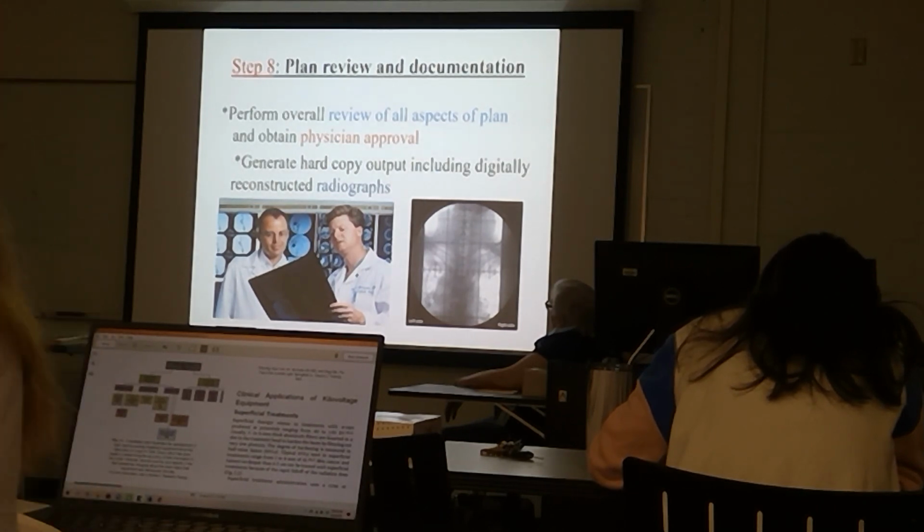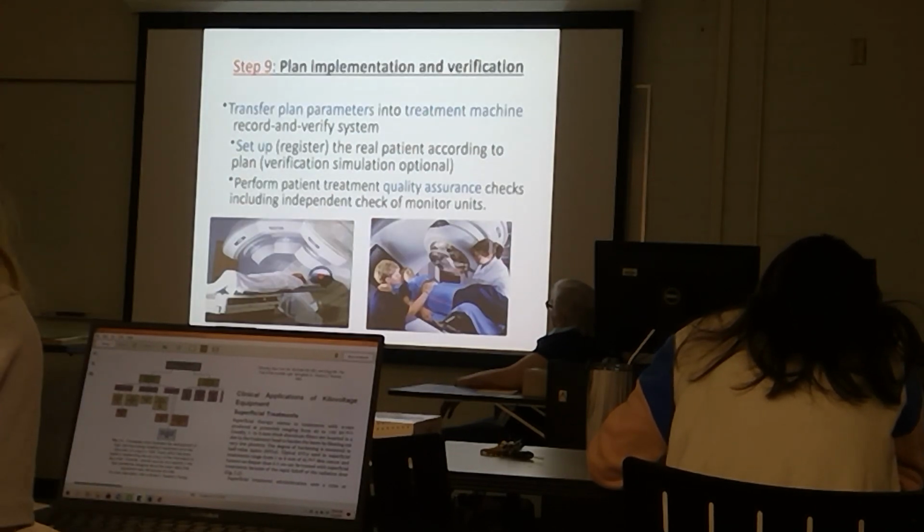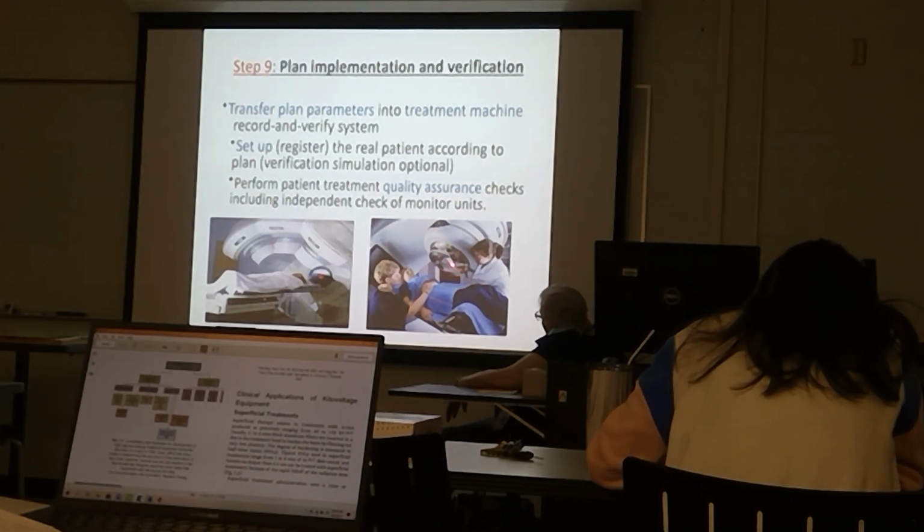Review and document. And then we verify the plan and treat. So what are they putting in here? What's this girl doing?